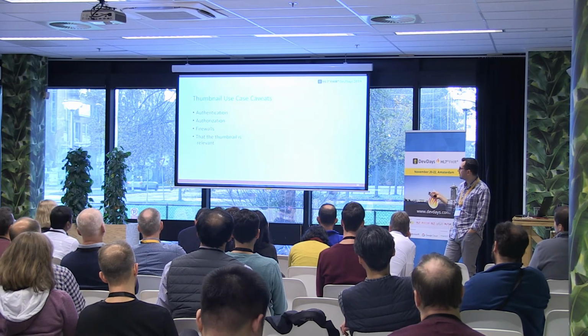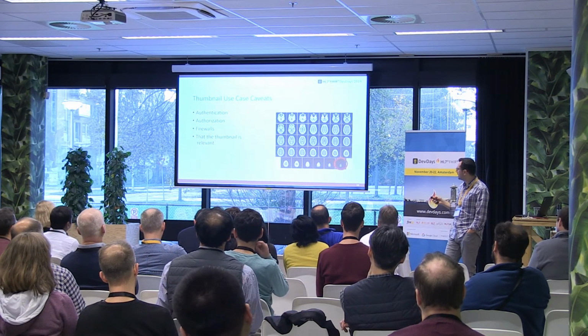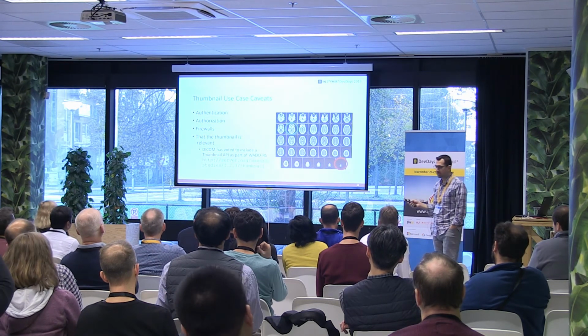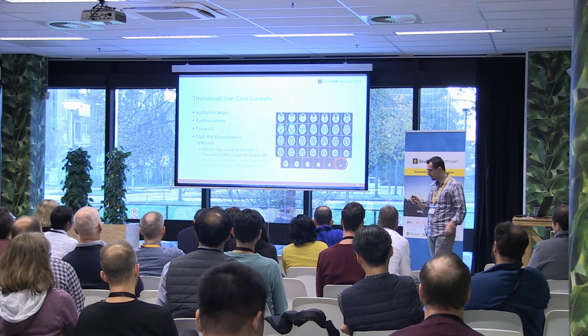Okay, so there's a little bit of talk about thumbnail here, but I think I'm probably gonna skip. What I will just quickly show you though is something to think about. So this is also one of the challenges that DICOM deals with. You have here a CAT scan, so you can see the progression. They're scanning somebody's head, right?